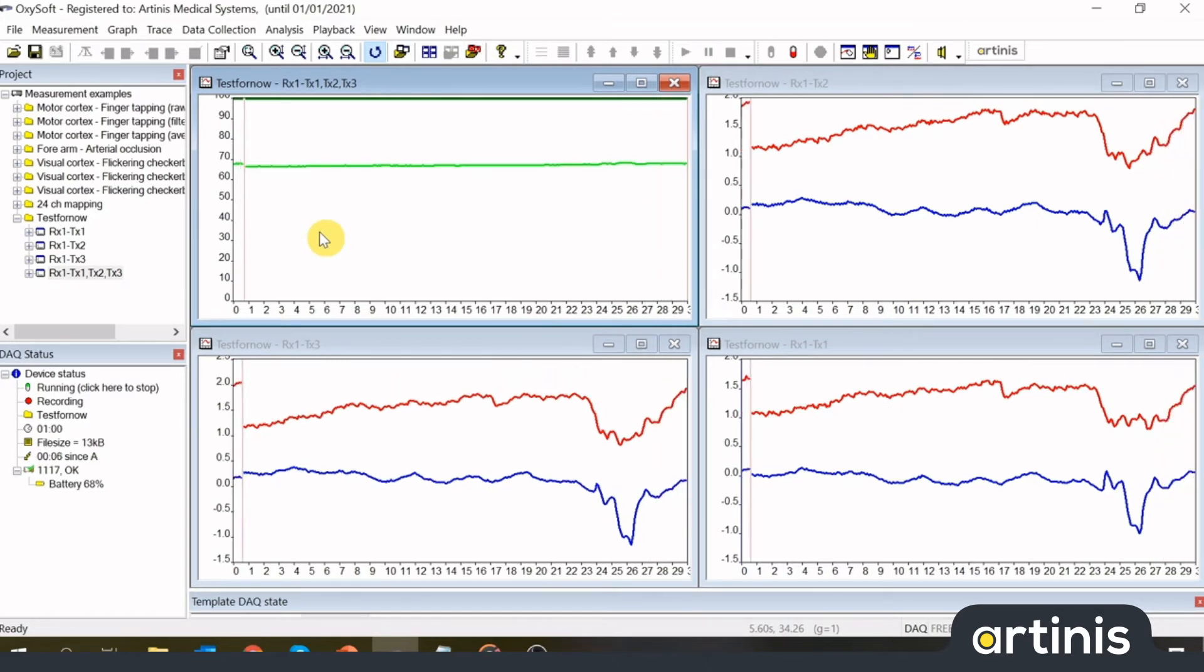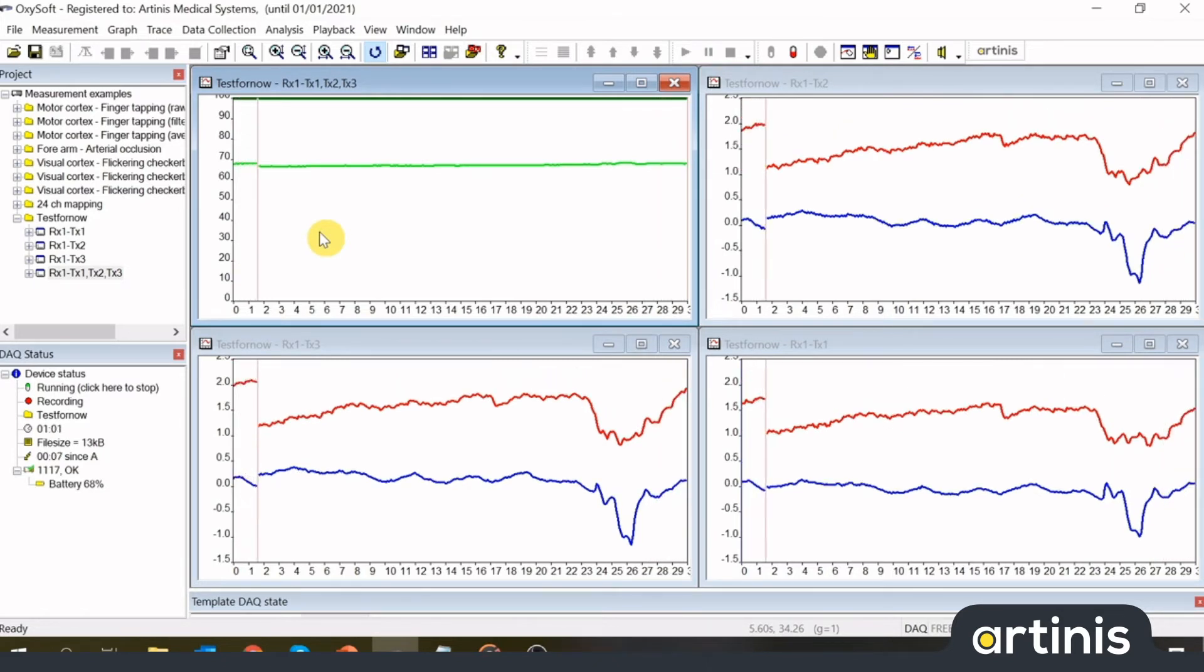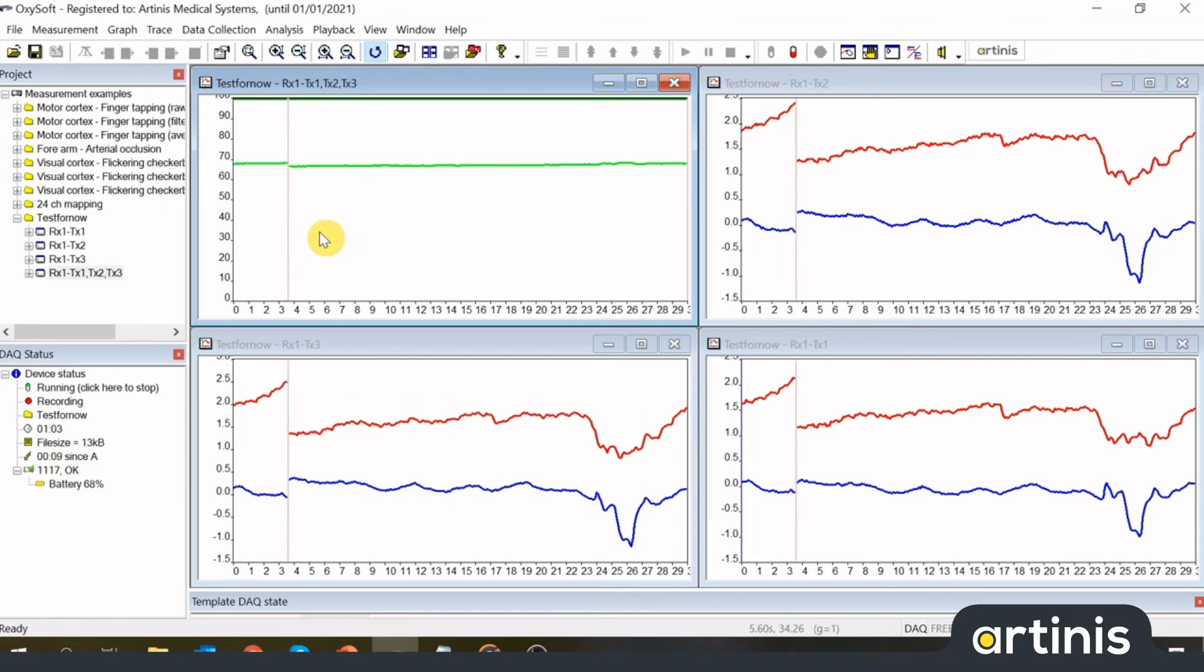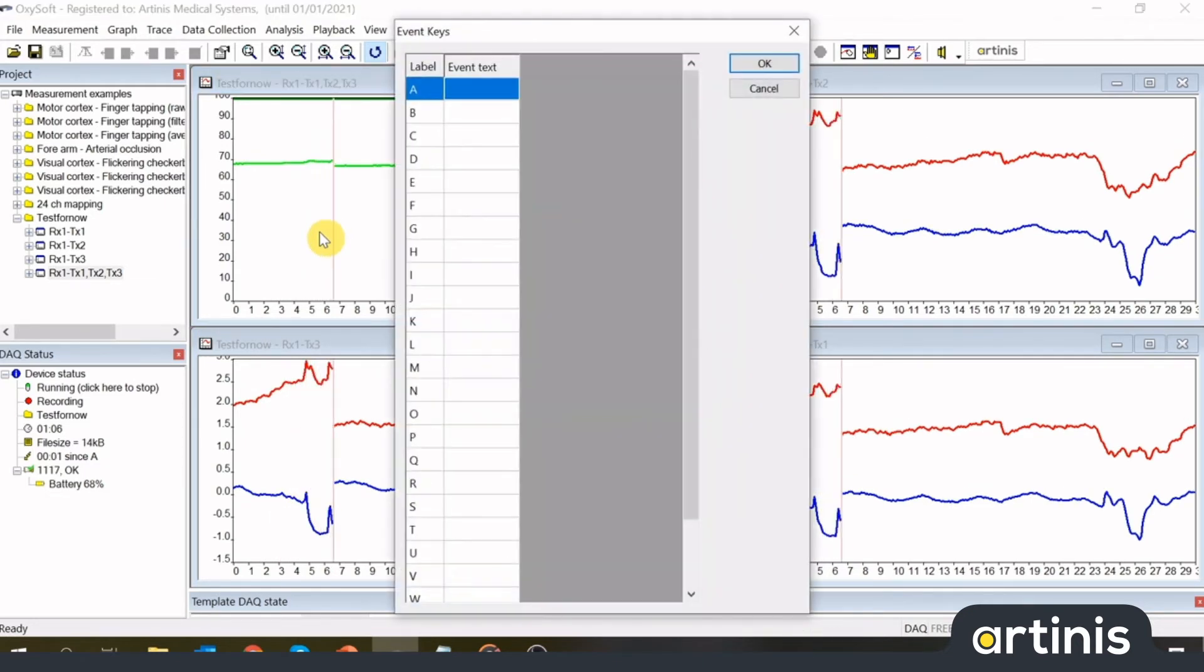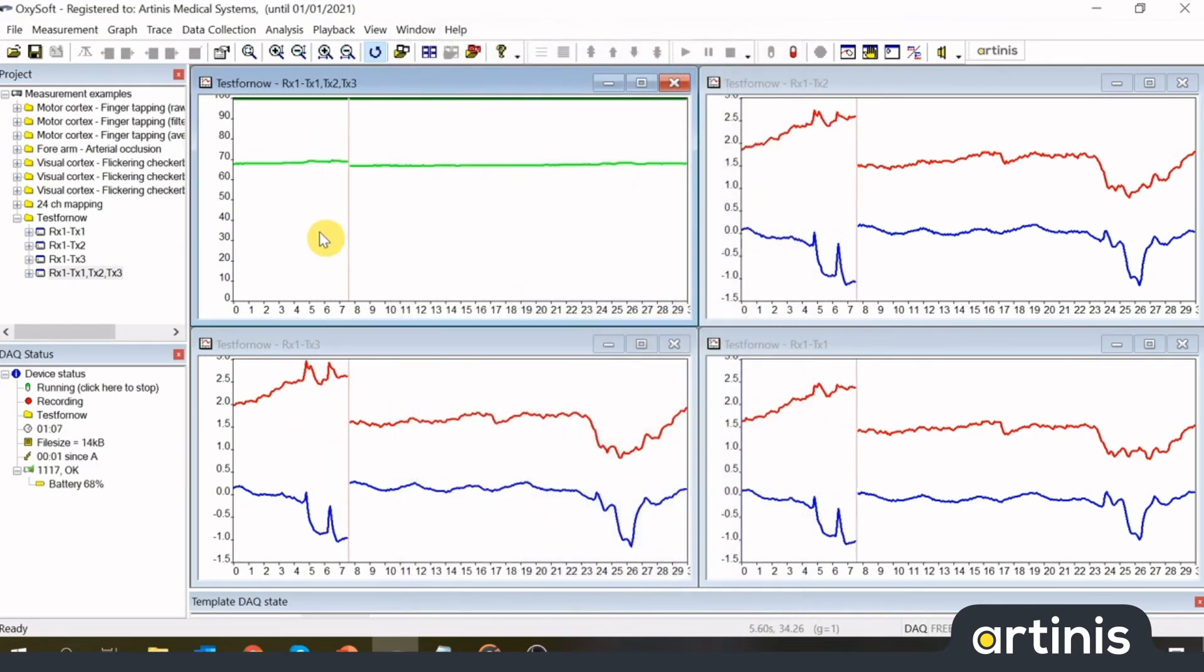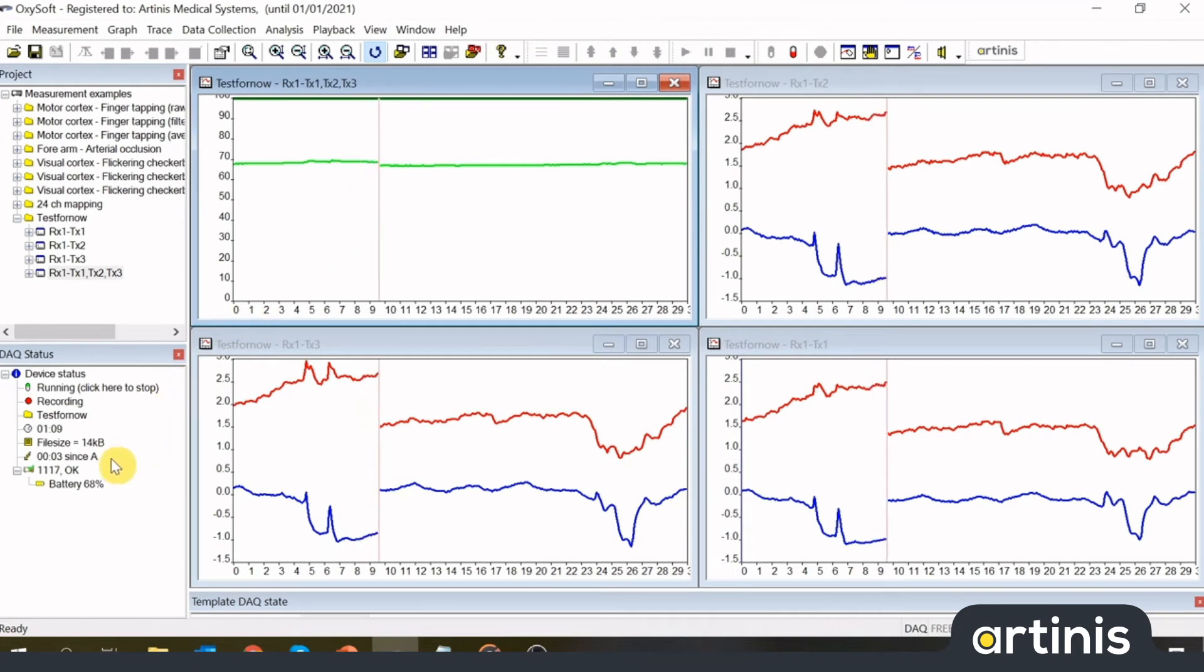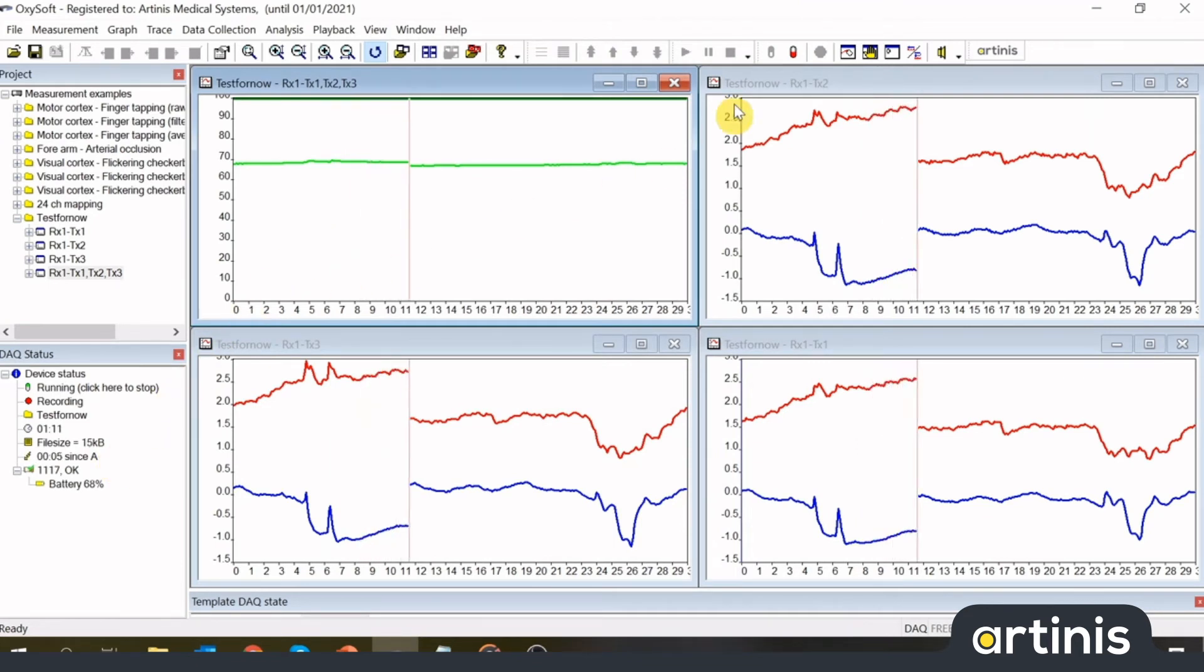Events cannot be changed during the measurement. Oxisoft automatically sets a 1 after the first event, and a 2 after the second event with the same event key. You can see the time since the last event in the DAQ status view.